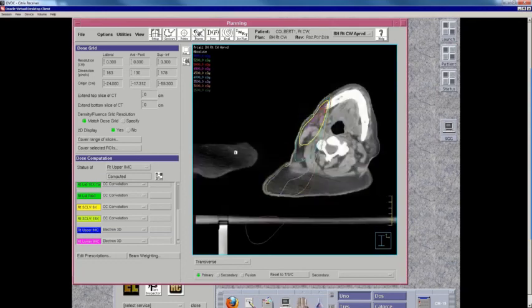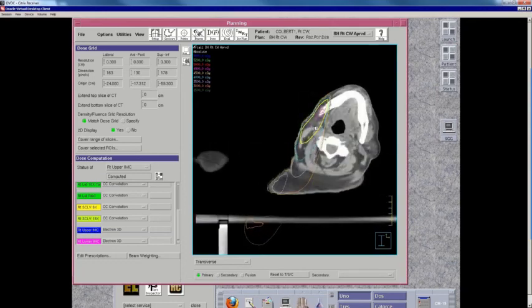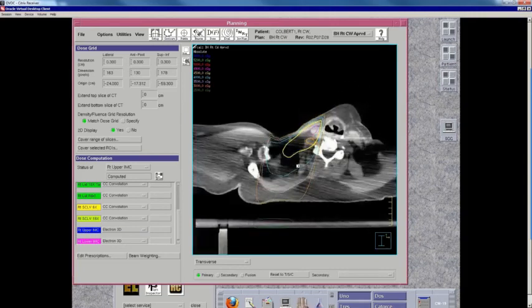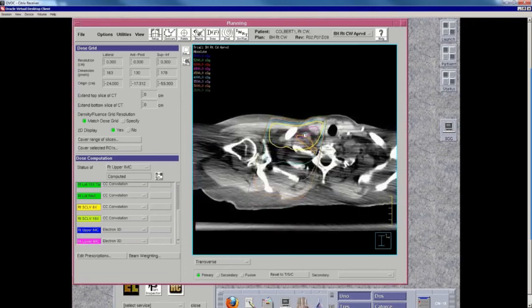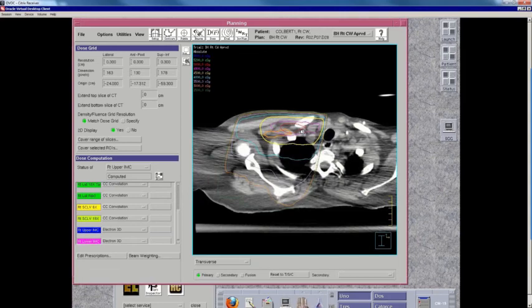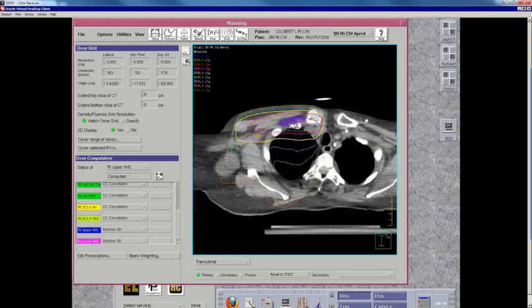And so here we go, starting at the top. We're just barely covering this nodal pocket here. Honestly, a little bit more mandible dose than I would love, but it's what I was stuck with. I couldn't otherwise get her chin easily out of the field. It's nice coverage of the supraclavicular lymph nodes, nice coverage of the infraclavicular lymph nodes. Here's my Rotter space coverage, covering that purple contour, which is really important in this plan.